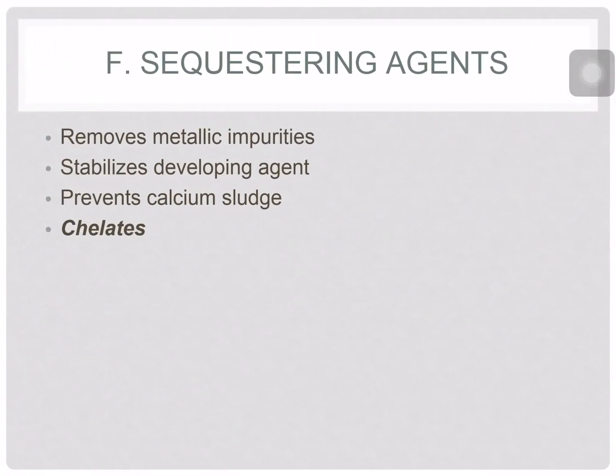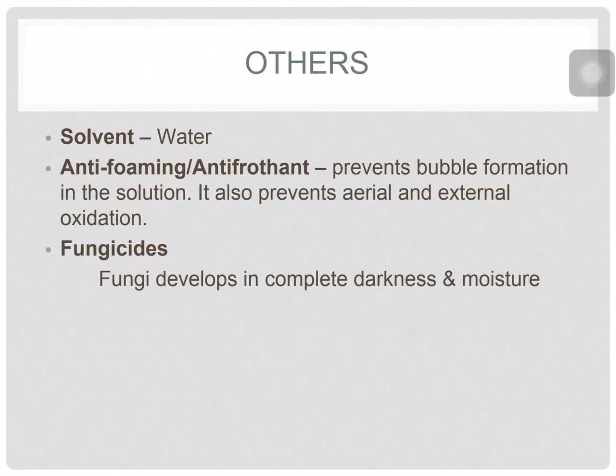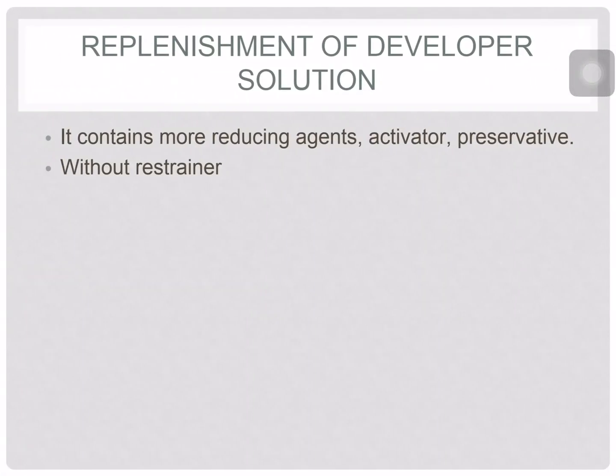Now let's go to the replenisher of the developer solution. Replenishment of developer solution contains more reducing agent, activator, and preservative. It is separate just to replenish the developer solution. This usually doesn't contain a restrainer unless the developer component used is the PQ developer.